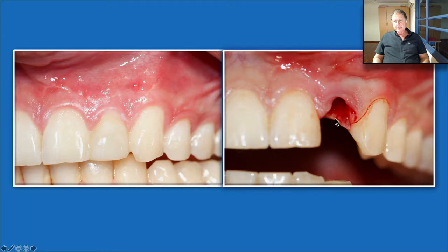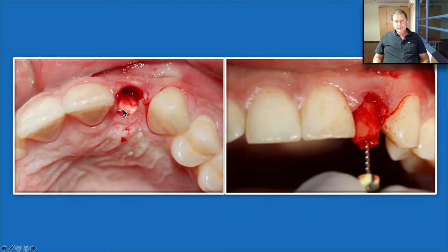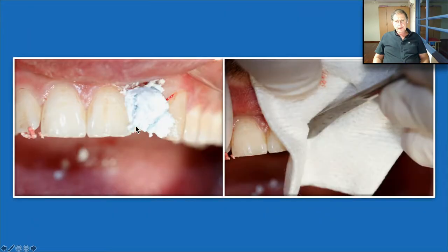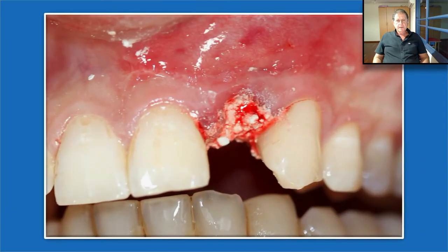The papilla is here. Now we need to remove the remnants of the root and inject the Bond Apatite cement inside. It's very important to take a dry gauze first, press with a finger, then with a periosteal elevator. The material must be very well compacted. We slightly overfill, as you can see here. The material is hygroscopic, so blood comes immediately into the material.